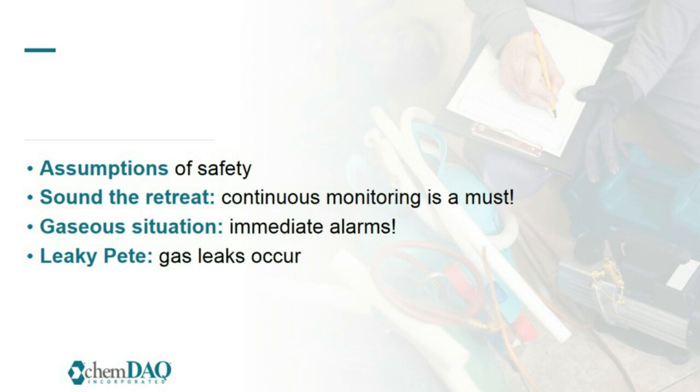One customer that I visited had 4 new Steris sterilizers, and with continuous monitoring discovered that each of the units emitted between 25 and 40 parts per million of H2O2, or hydrogen peroxide, upon opening the door. So upon discovering that, this customer now sounds the retreat. I can almost hear the bugle blowing where they sound the retreat, they open the door and they run out of the room and they let the room aerate until they believe that it is safe. They return to the room to take the load out of the sterilizer.